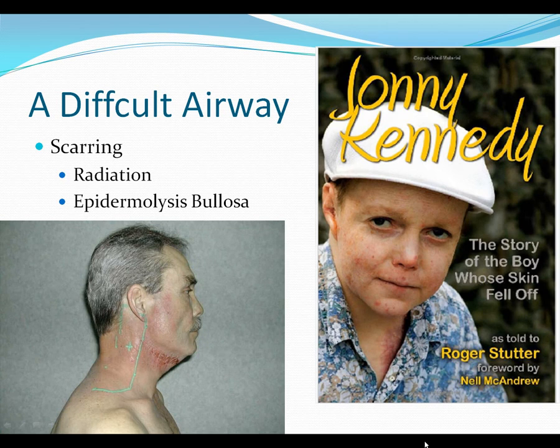So it might not look like a bad airway from the outside, but when you get down to it, you might not be able to open the mouth very well. You might not be able to get very good exposure with the laryngoscope.